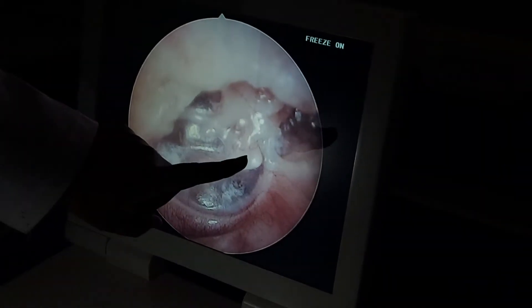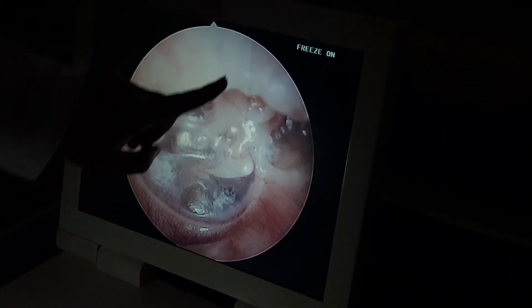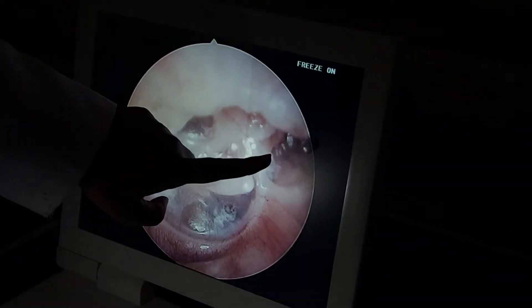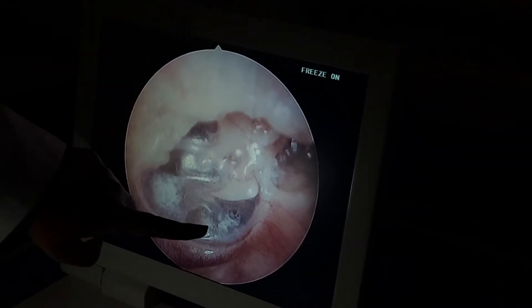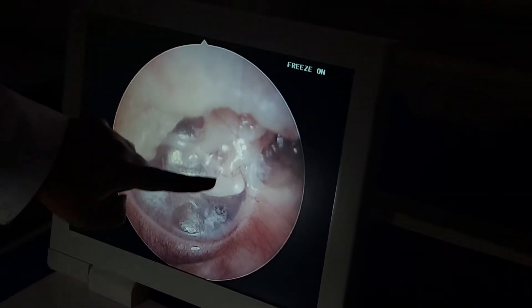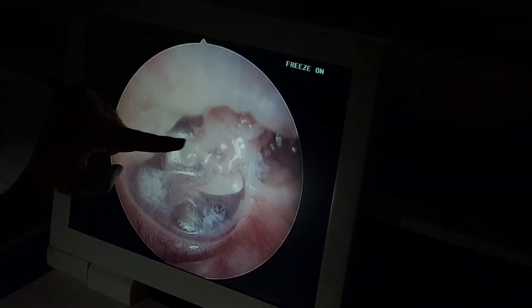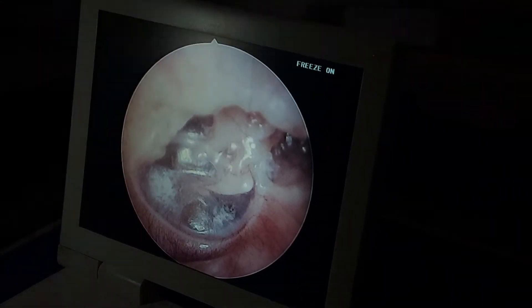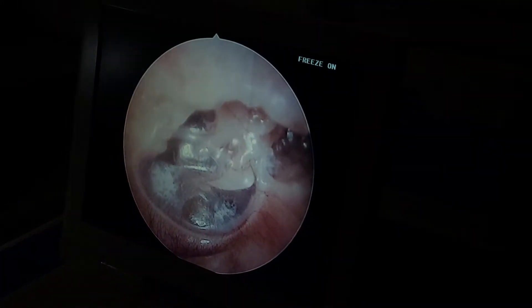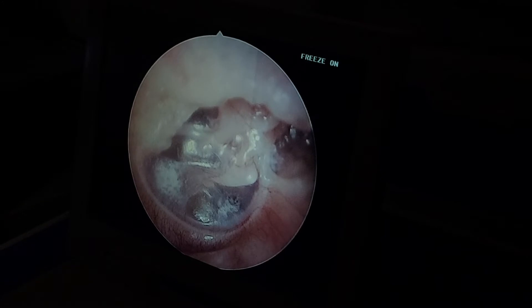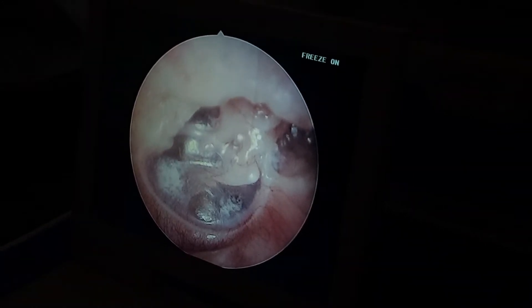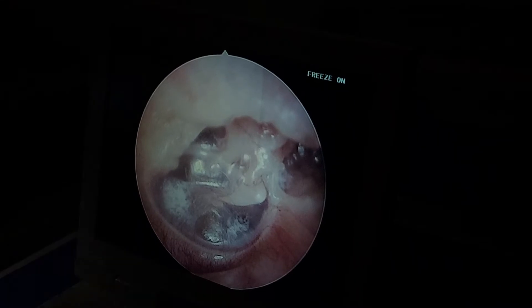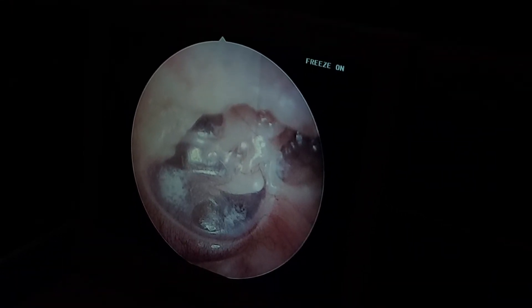This is waxed and it looks like a retraction pocket. This is attic, isn't it? It's attic. This is not the same. This is the pars flaccida portion. It's not perforation. This is not perforation.